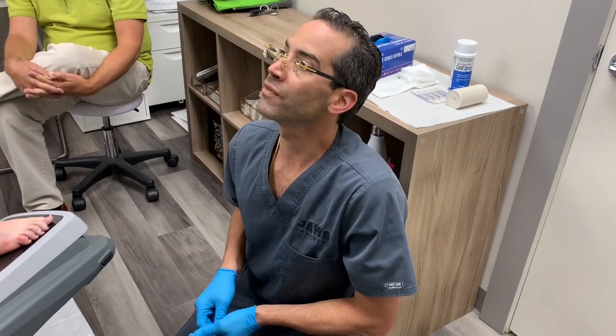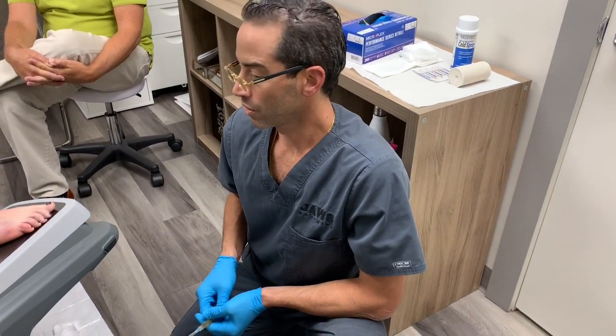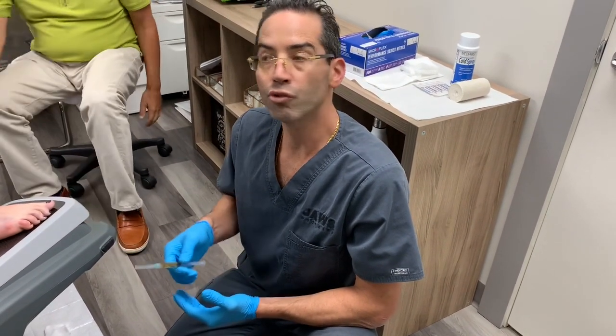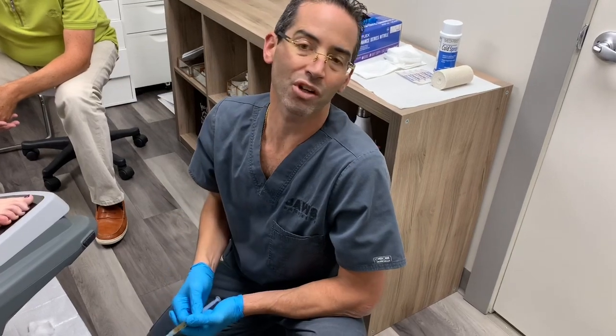We're going to go ahead and inject a little PRP into the fracture site using our C-arm fluoroscopy machine. We have the great fortune of having this machine here, and we're able to use these live images to deliver the PRP exactly where we want it to go.